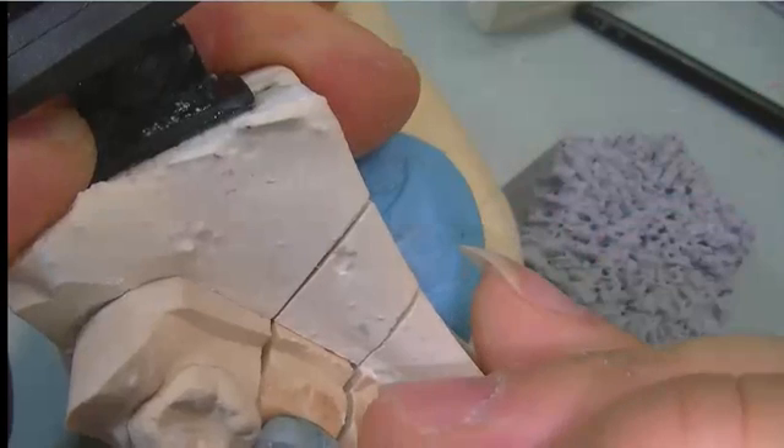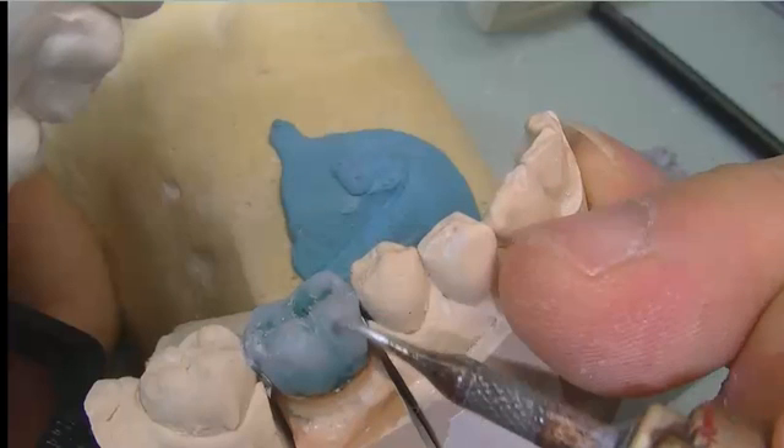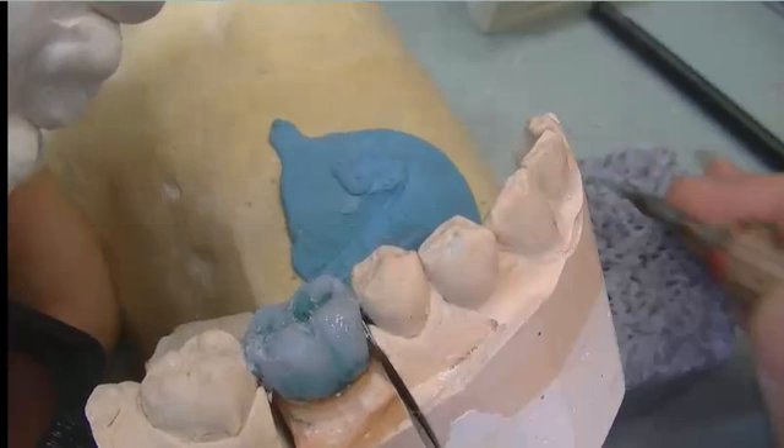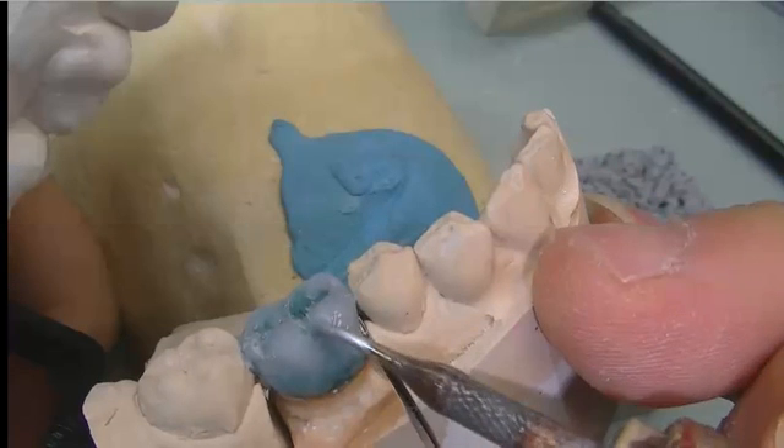On top of the coping, we are putting some gray wax. When we close down into occlusion, we will be able to see whether it's high or low, or whether we need to fill in with some more wax.